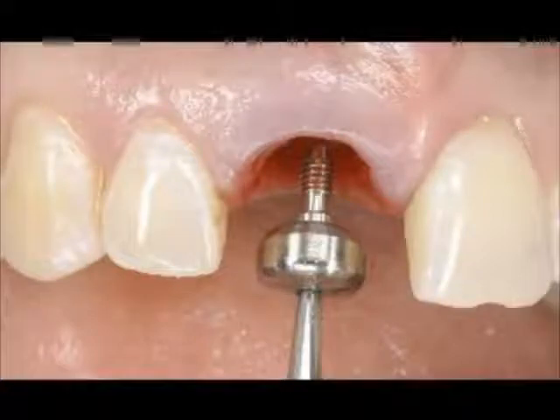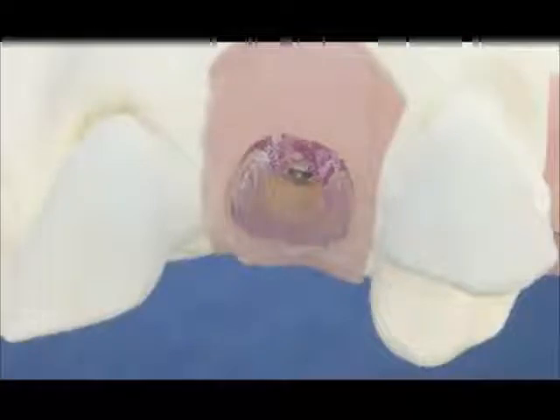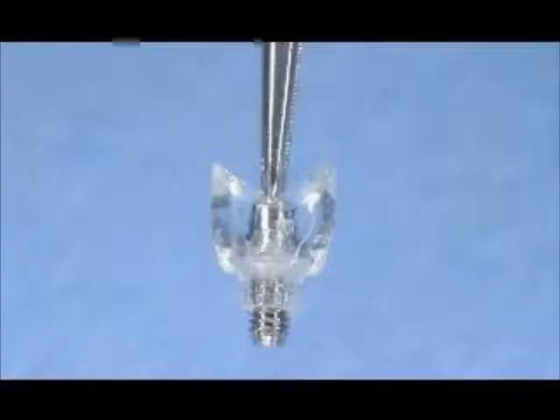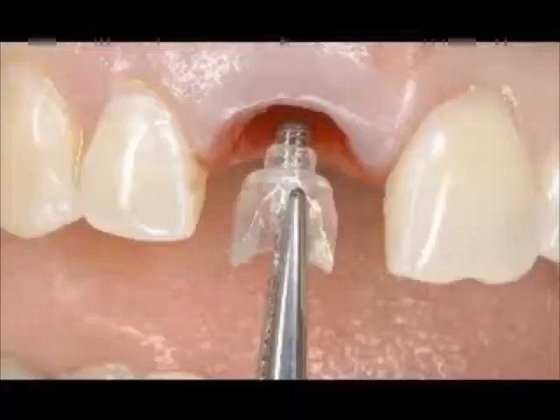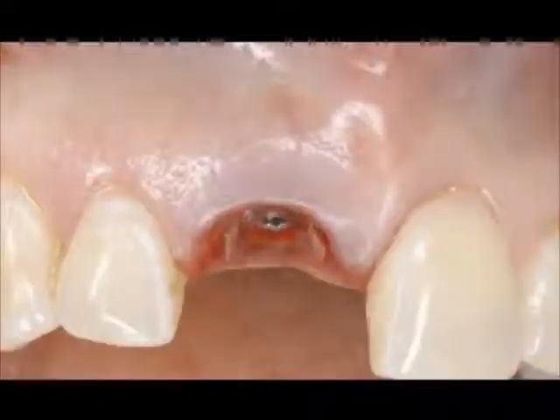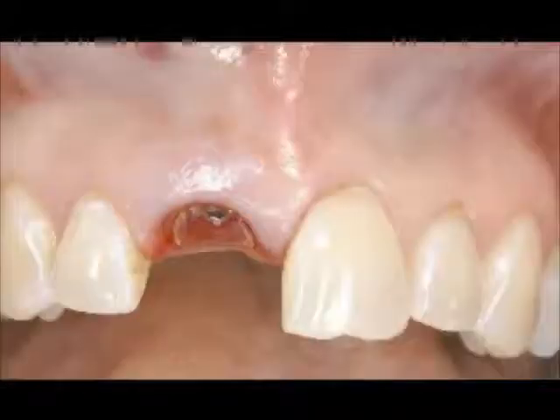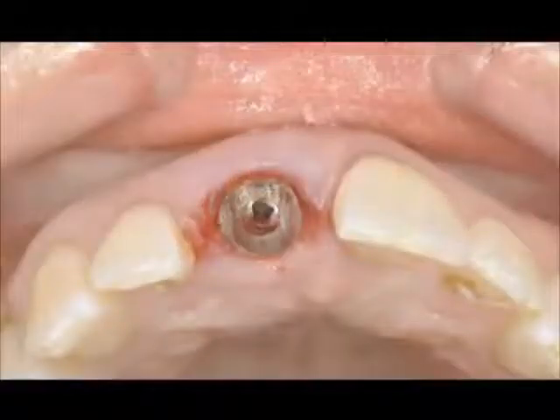So if I was to take this out and replace it with something I think it's even better, would be a natural contoured clear cap that is hardened plastic material and that gives you the interproximal shape for support of the papilla. I believe that this is a much better alternative to a staged healing approach than the old tried and true circumferential rounded flat healing abutments that have been available with most systems.